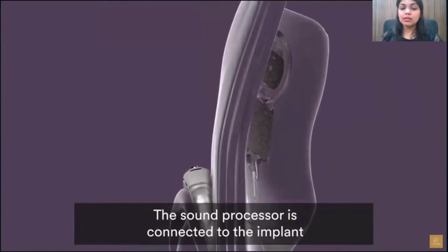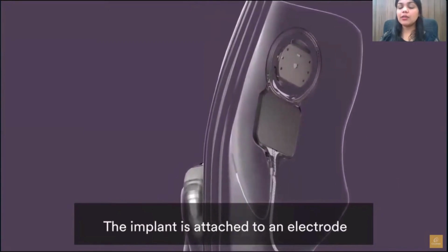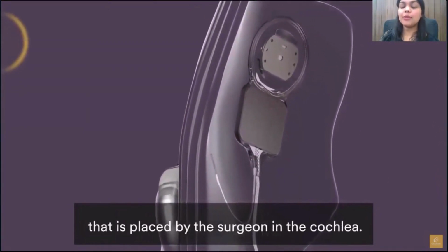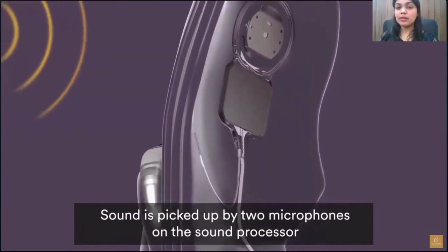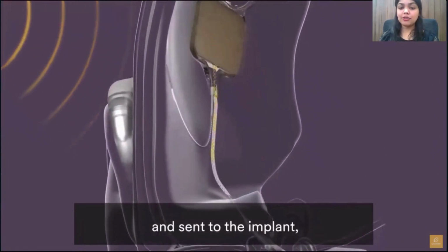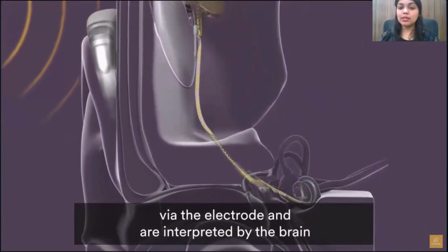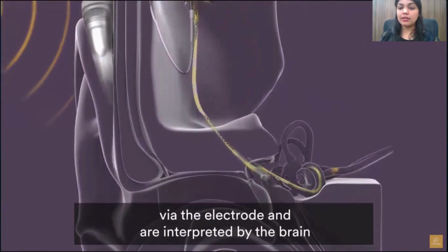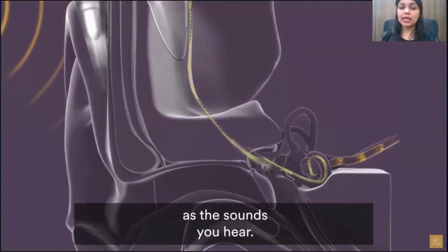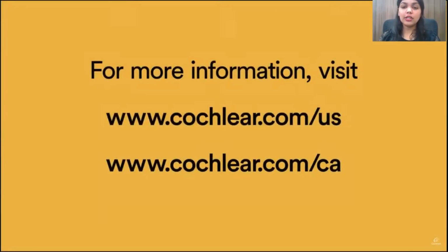The sound which is processed using the processor is further transmitted to the internal receiver stimulator through radio frequency. From the receiver stimulator, it travels down to the electrode array as electrical impulses. These electrical impulses further stimulate the auditory nerve, and then it works like normal hearing. So that is how a cochlear implant system works to provide hearing sensation for the user.